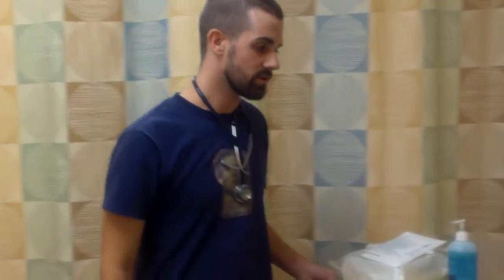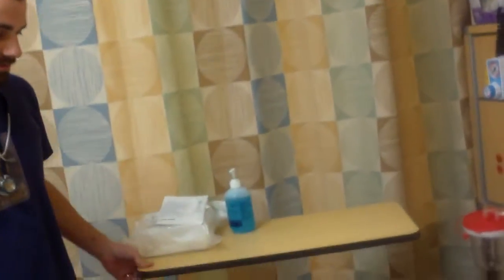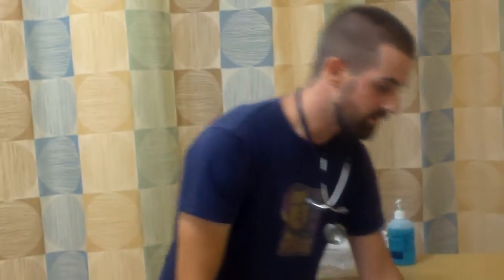I'm going to knock in the room, and once I gain entry I'm going to say, hello, my name is Jacob. I'm a student nurse with Madison College. If you can state your full name and date of birth for me. And I'm also going to check the patient's ID marker so I know who I'm dealing with. I'm also going to ask her at this time if she has any allergies, just to confirm that with the chart. There are no known allergies, so then I'm going to provide for privacy.